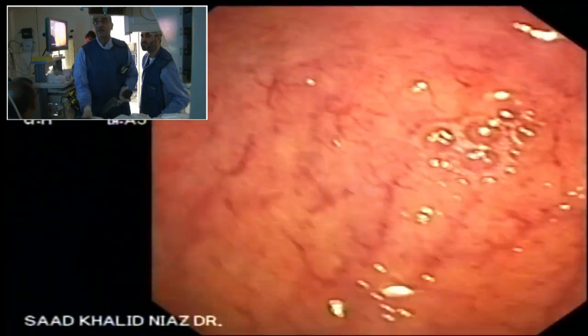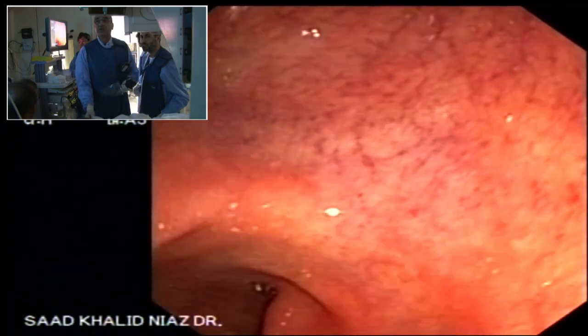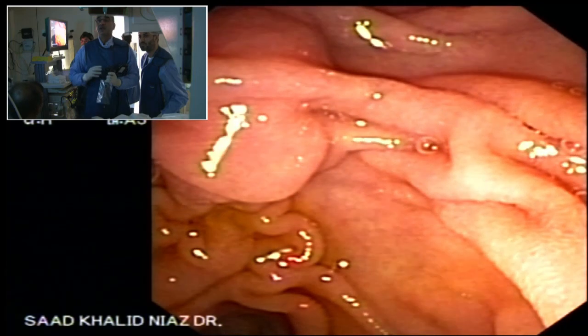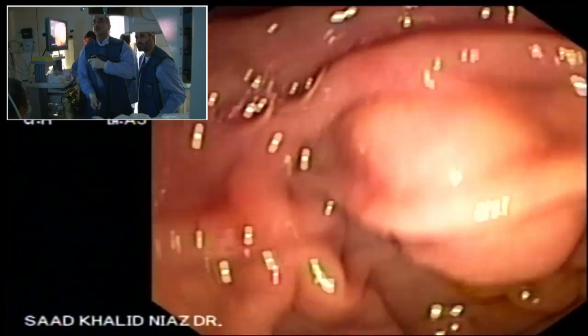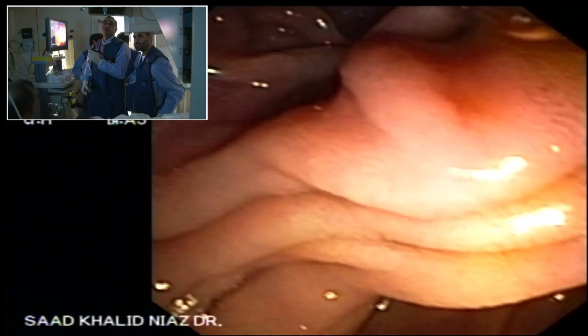Right, so you find where you have to go. It's good to take the air out because if your stomach is over-distended, it's difficult to traverse the stomach. So within 2 seconds you are back in the duodenum, right? So we go back into the second part of the duodenum. You see that sunset, right? Now when you are moving comfortably, you put your scope in right lock, and then as you are coming out of the pylorus, even from the duodenal apex, I'm doing exactly the same as we have done, the duodenal sweep, so that the scope also has to be at the sunset for the scope to go, and you get in position, right?